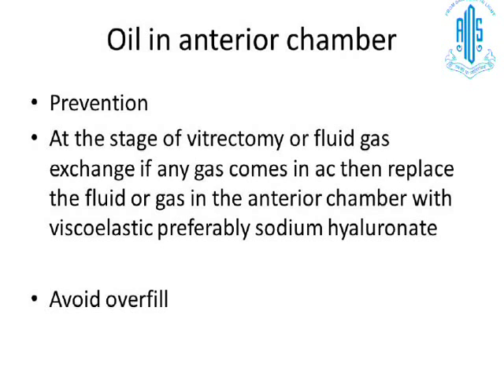At the stage of vitrectomy or at the stage of fluid gas exchange, if you find that there is a danger of anything coming into the anterior chamber, it's best to fill the anterior chamber with a viscoelastic, preferably sodium hyaluronate. That's what I do if I feel that this is a pseudophakic patient and there is maybe zonular dialysis, maybe the gas or the oil is going to migrate up. I just fill the anterior chamber up, make it taut with the sodium hyaluronate, and then usually at the end of surgery, we remove that sodium hyaluronate, and this usually avoids the oil.